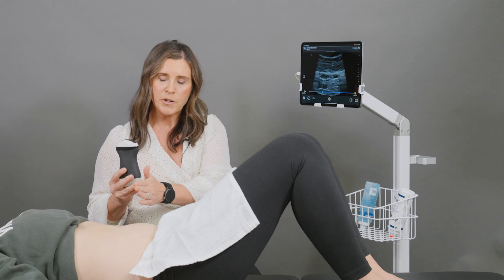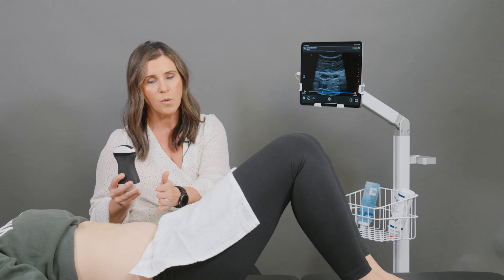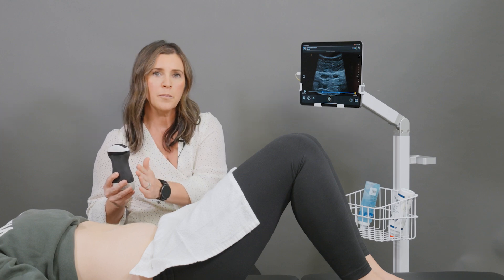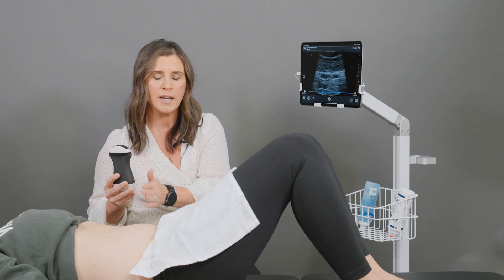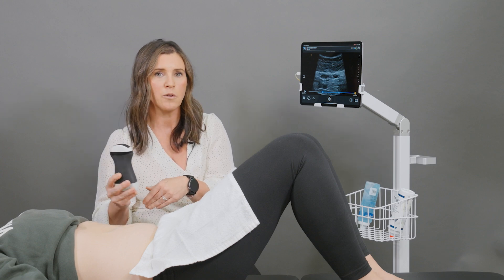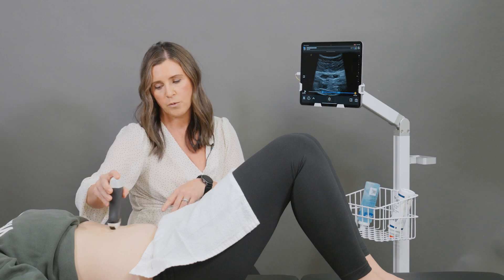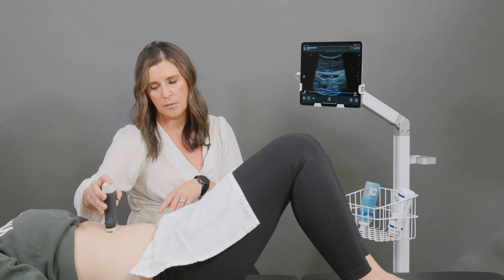When we're measuring interrecti distance, we can measure at different points through the abdominal wall. It's best to pick a point or several points that you can reproduce. You can do that by measuring with a measuring tape and just marking out those spaces. For the purposes of today, we're just going to go about three centimeters above the umbilicus.